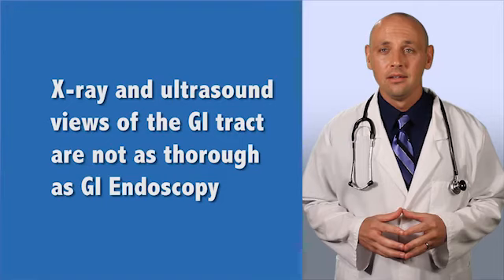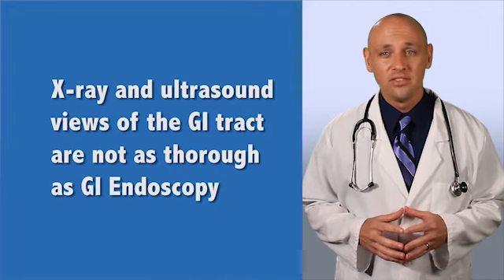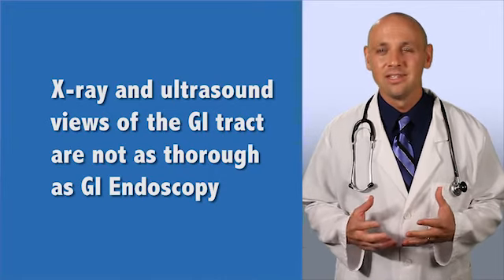Are there any alternatives to GI endoscopy? There are some radiographic procedures that provide limited views of the GI tract. They are not as thorough as endoscopy. Also, they don't provide the means for sampling tissue in the intestinal tract. If you are concerned about your GI endoscopy, discuss your options with your doctor.